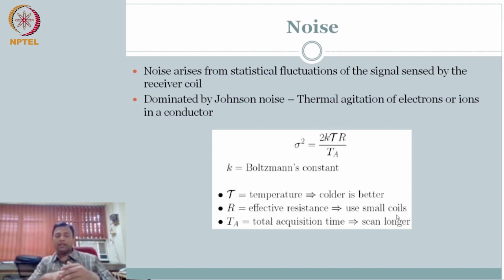So if I did wrist, I told you there is a body coil, and then they make dedicated coils, wrist coil, knee coil, head coil, name it, that is there. Why do they do that? Oh, I want to use a small coil. So if I want to image wrist, rather than imaging it with the receive coil in the bore, the body coil, I would rather have a receive coil that is small, right? So that I can reduce the noise. Therefore, I can have better signal to noise ratio, right? So reduce noise by reducing this effective resistance, which essentially comes from the body resistance.